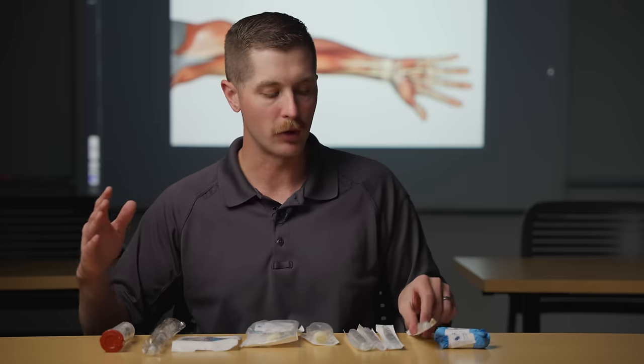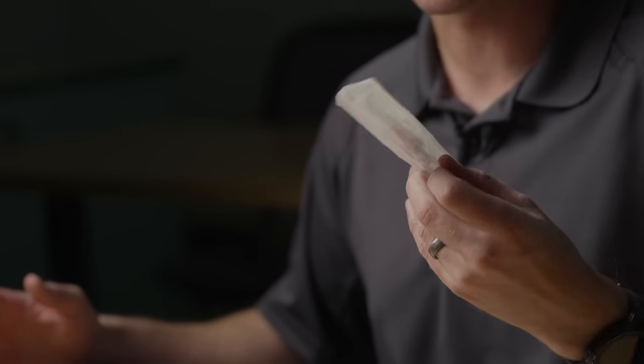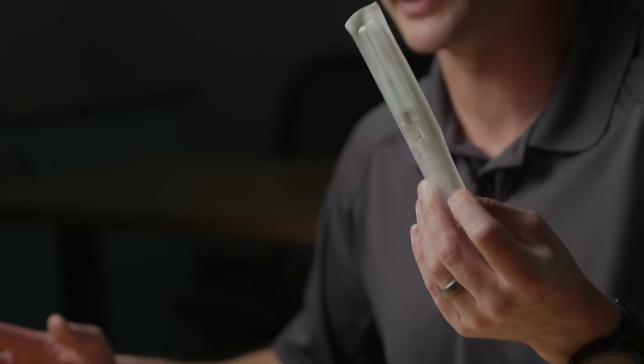This is what we're starting on small children. We've got a 22 gauge and a 20 gauge, which is kind of a standard sizing for IVs, and then we have an 18 gauge.